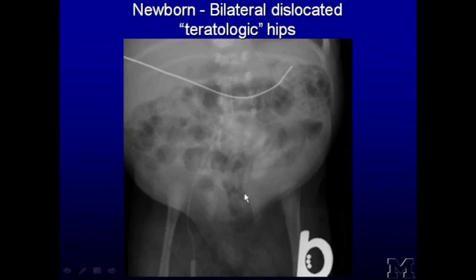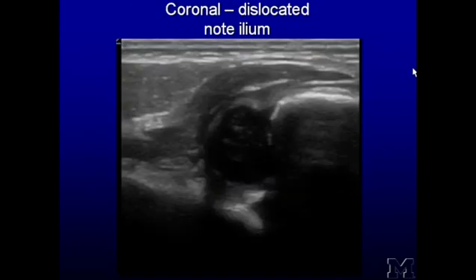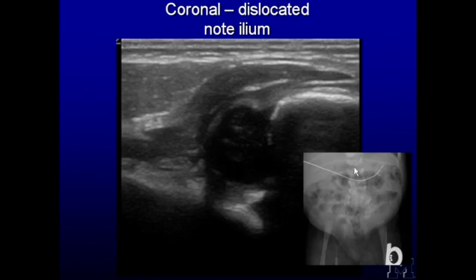But I'm showing you this picture to show you how sometimes on radiographs it's very, very obvious that the hips are dislocated. Now in this child's sonogram, this is the femoral head here, which now you can see, and this is the ilium, but you're nowhere near any of the normal anatomy of the acetabulum. This is very, very posterior, just as it was on the radiographs. So you can see here, rotate that 90 degrees counterclockwise, and you get this picture.